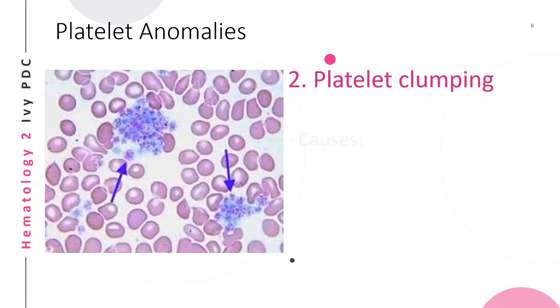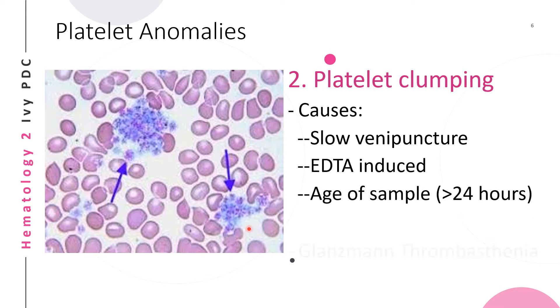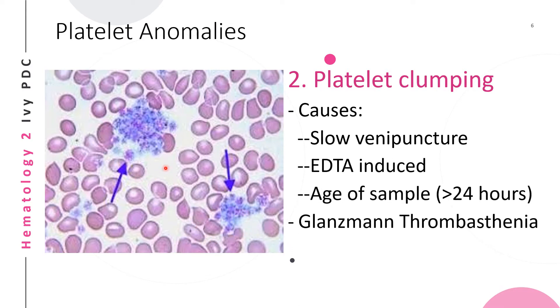The second platelet anomaly is platelet clumping. This is the phenomenon where platelets are seen clumped or grouped together in a peripheral blood smear. The cause of platelet clumping is not always pathologic — one example is a slow venipuncture, where platelets clump because of very slow extraction of blood.